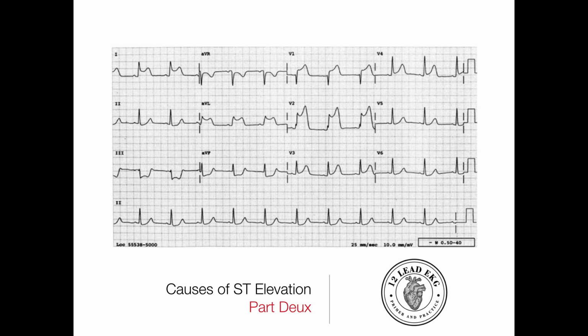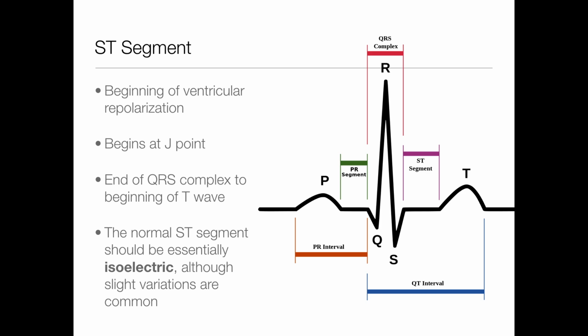Right, so it's time for part 2 of causes of ST elevation. So let's get through that. We've already done part 1. There's another video up for that if you haven't seen it already.